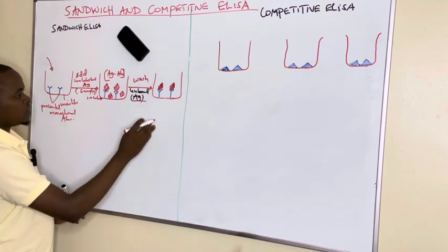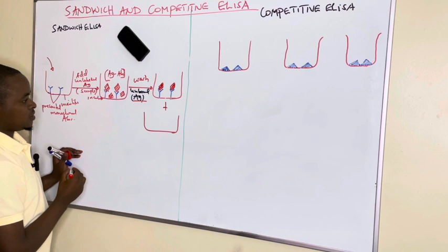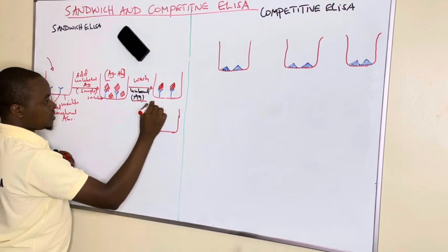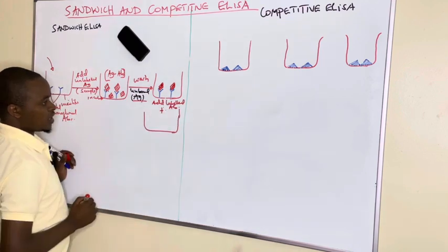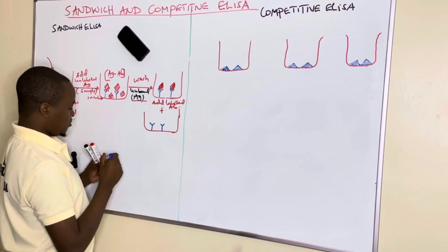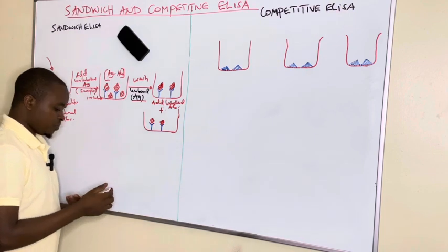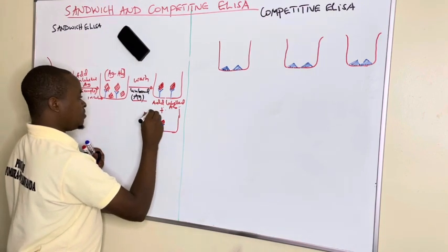After remaining with only the bound, the next step is to add the enzyme-linked, labeled monoclonal antibody in the reagent. The antigen was in the sample; this is the antibody in the reagent. The microtiter well is already pre-coated with a monoclonal antibody, and there is already an antigen bound from the sample. So the labeled antibody comes and binds on the epitope of the antigen from the sample.